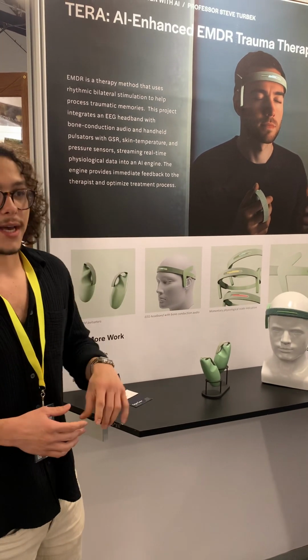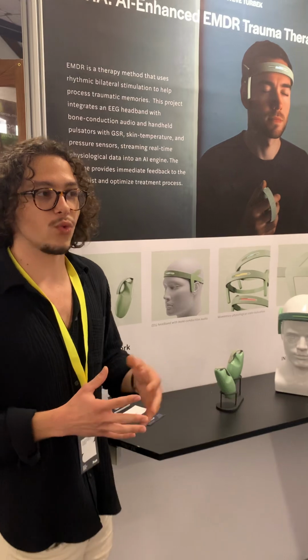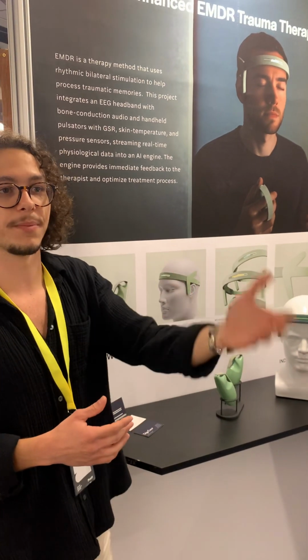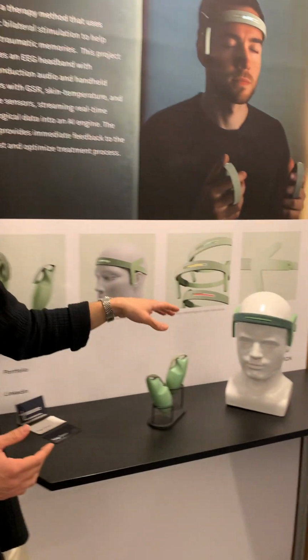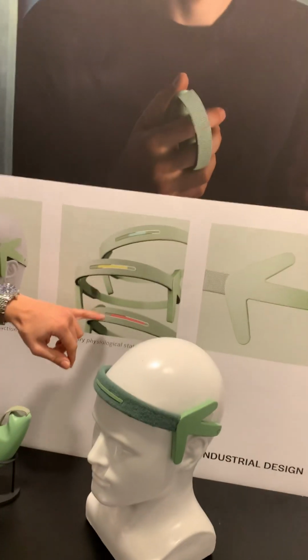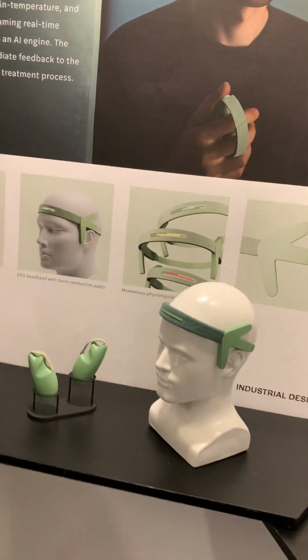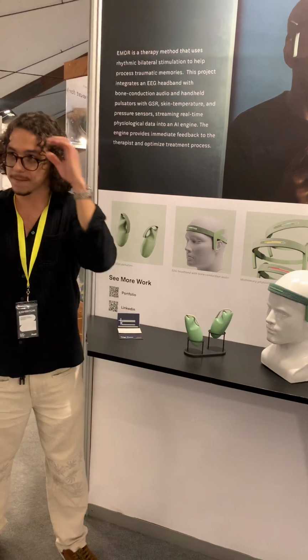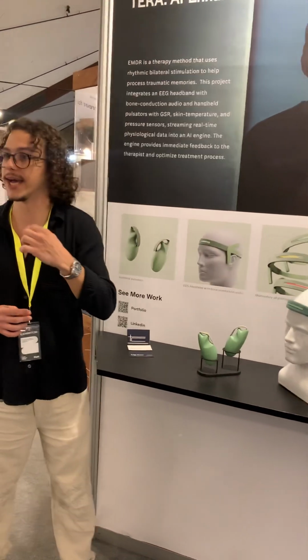Throughout this process, I didn't want the therapist to lose their focus on the patient. So I also included a front bar that shows the momentary state of the patient through different colors and different values shown on the headband.